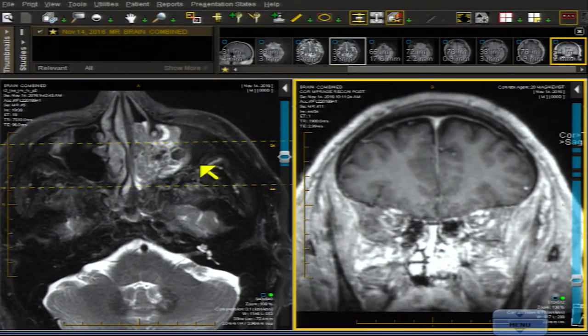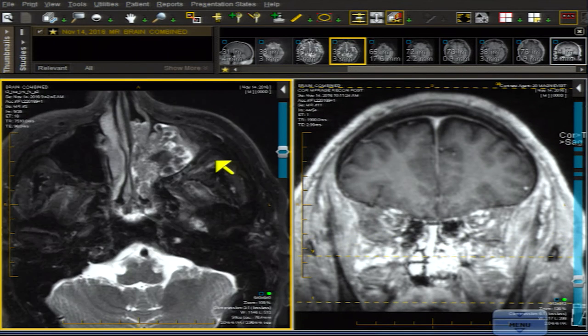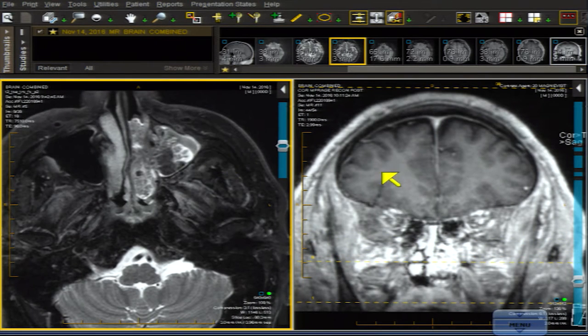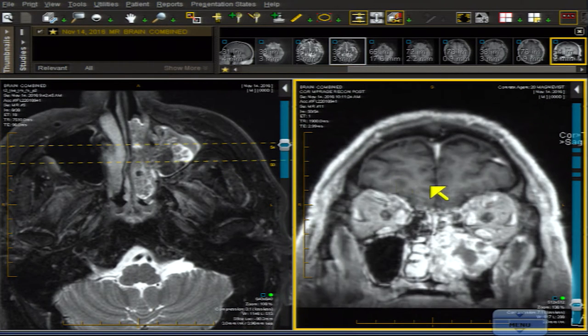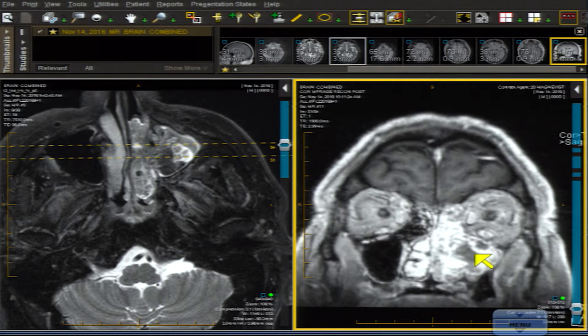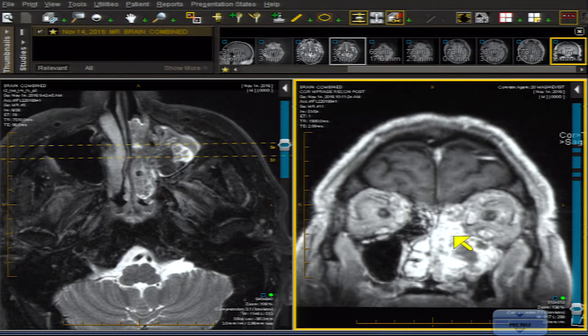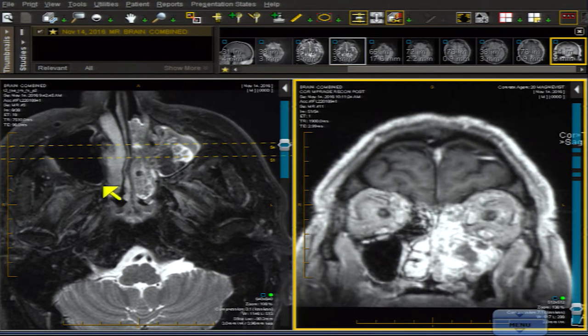This first case is a 60-year-old man with a mass in the face, particularly in the nasal cavity area. Here's an axial T2-weighted image on the viewer's left and a coronal MRI T1 contrast-enhanced image. There is a large mass filling the left maxillary antrum, spilling over the infundibulum into the hiatus semilunaris, and truncating the uncinate process, which isn't seen. It extends all the way up into the ethmoid area.